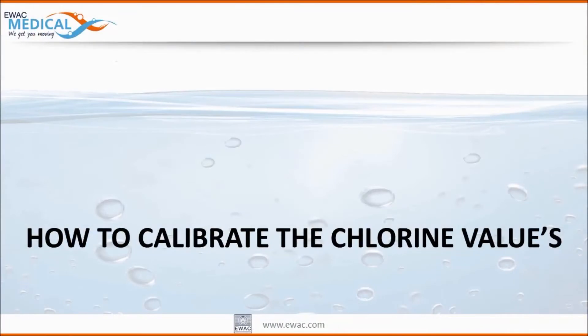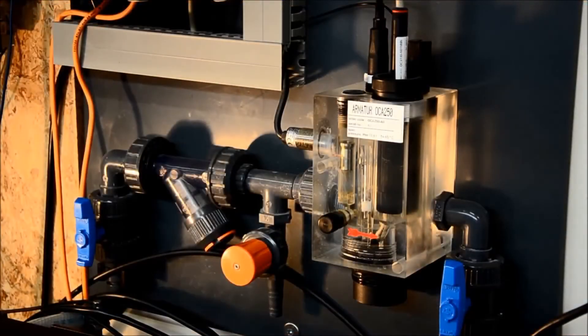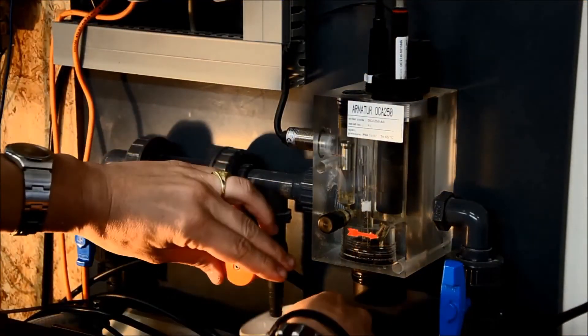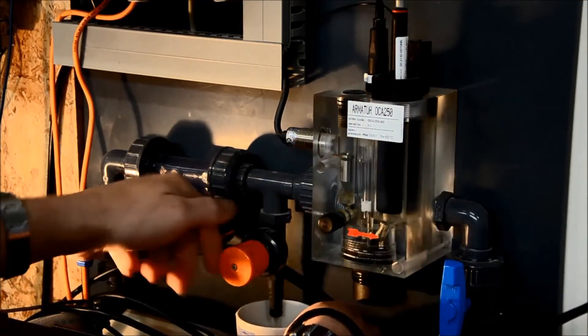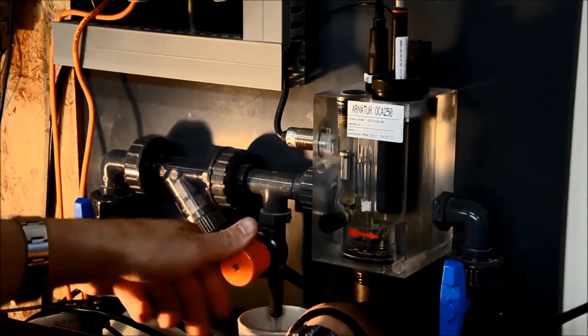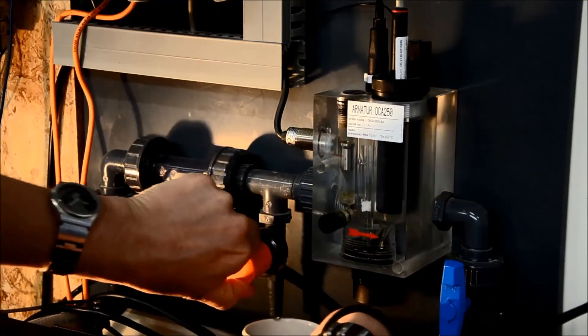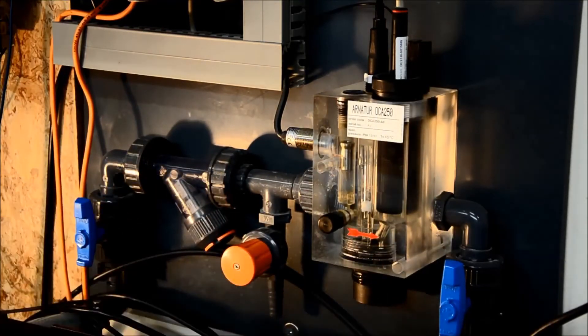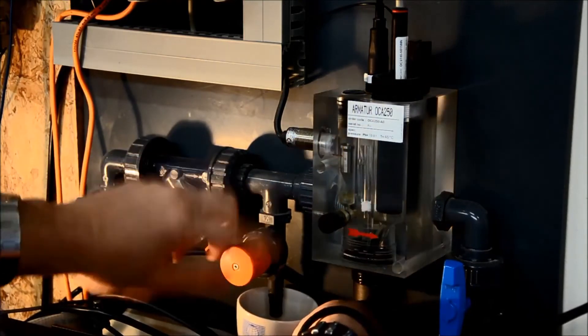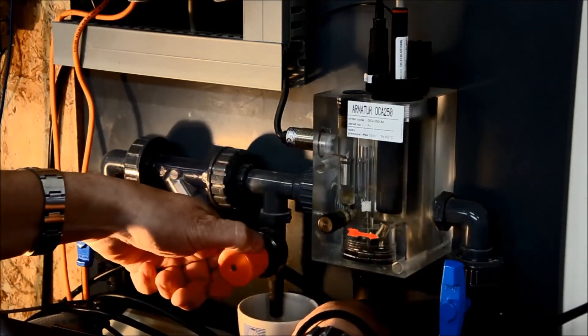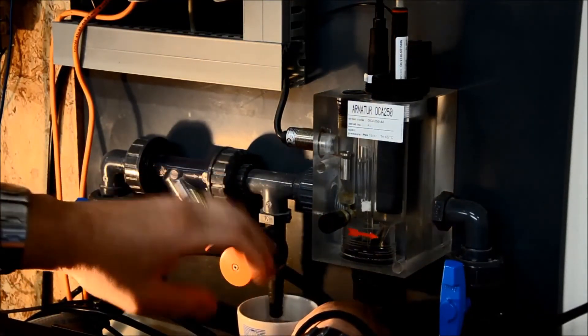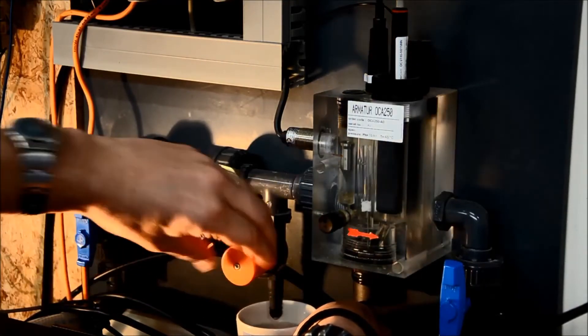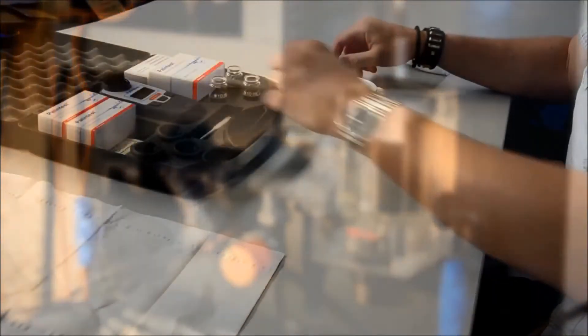How to calibrate the chlorine value? Open the sample tap and pour about a coffee cup of water from the system. Throw this water away. And then pour another coffee cup full of water. With this water we will perform the measurement.